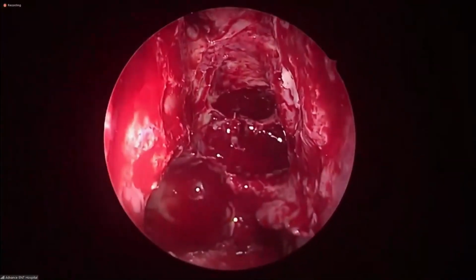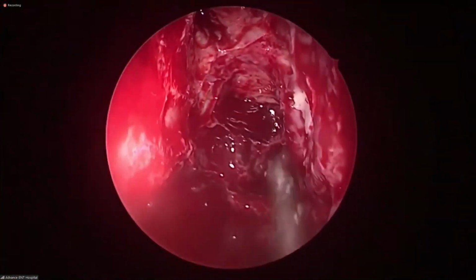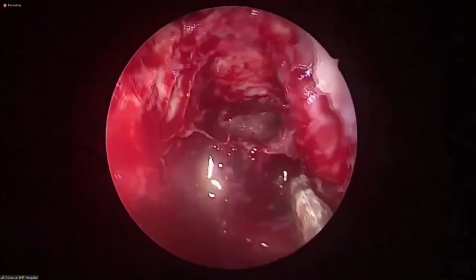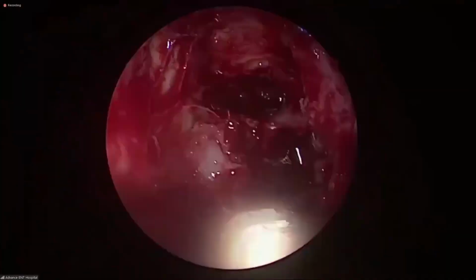Clean. That is the posterior skull base. Yes, sir. This is posterior.